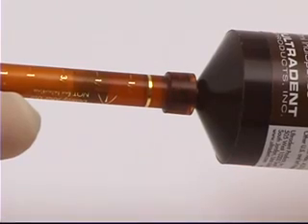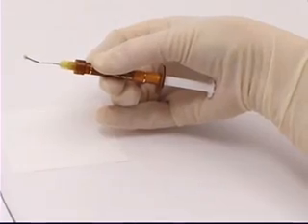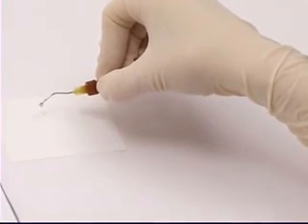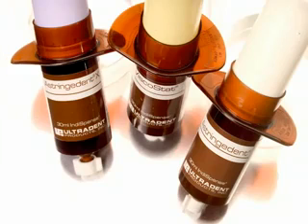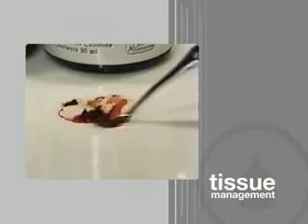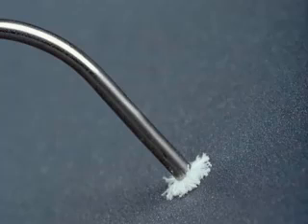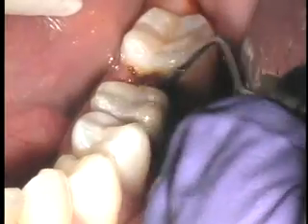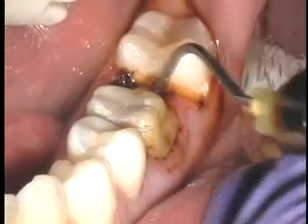Between 0.3 to 0.5 milliliters of solution is usually adequate for one preparation. A dental infuser tip is attached to the syringe. To ensure smooth and consistent delivery of Viscostat, hold the syringe using the palm of the hand rather than the thumb to depress the plunger. Check for evenness of flow before dispensing intraorally. The hemostatic solution is rubbed firmly against the bleeding cut tissues until bleeding stops. The rubbing motion also wipes off excess coagulum, making it even with the cut tissue surface.